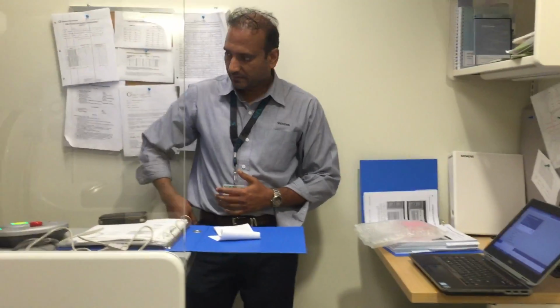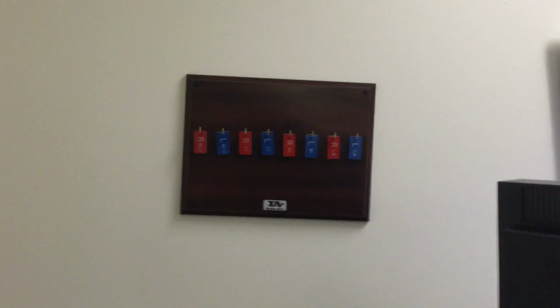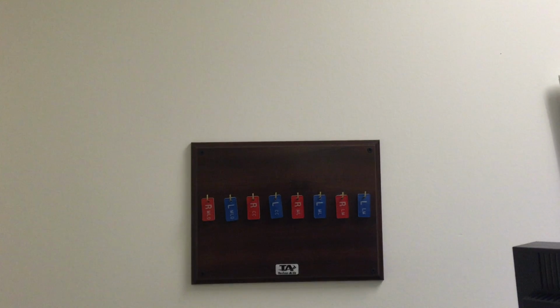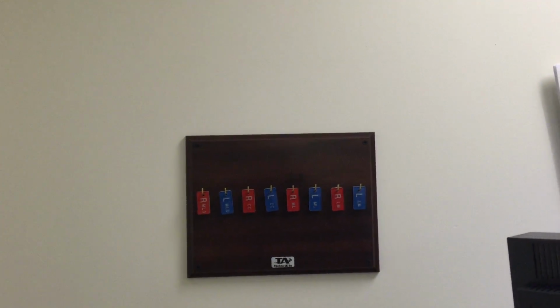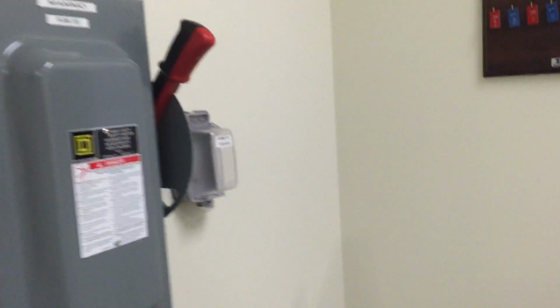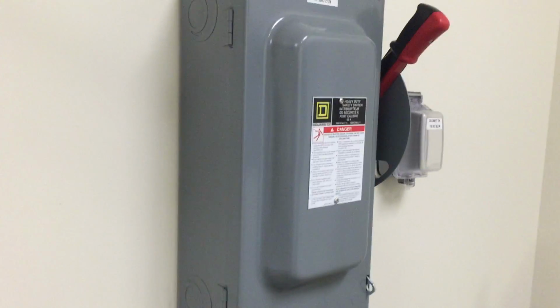So tell me about this color coding here. LO, okay, for the designation. LM, to mark your image. CC. Okay. CC, MLO, okay. And is this supplied by Siemens, or do you have to buy it locally?